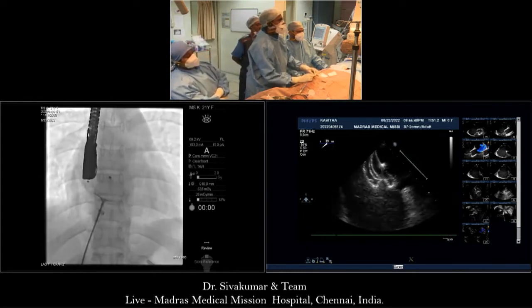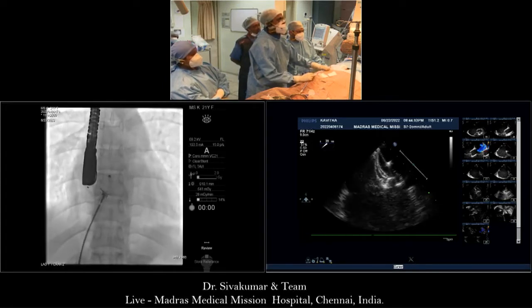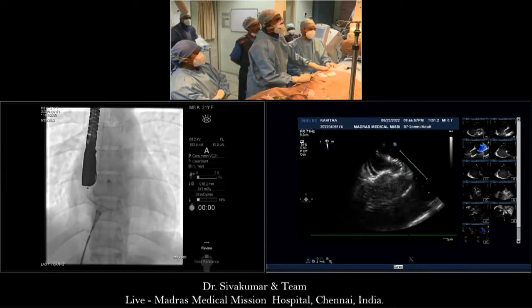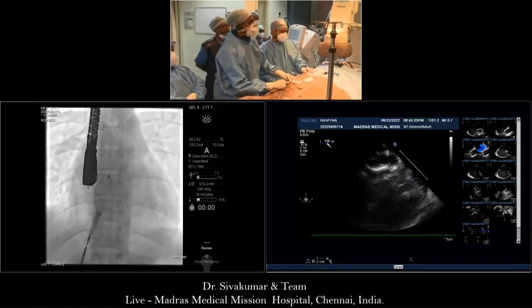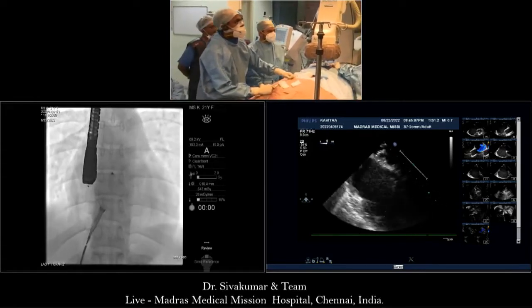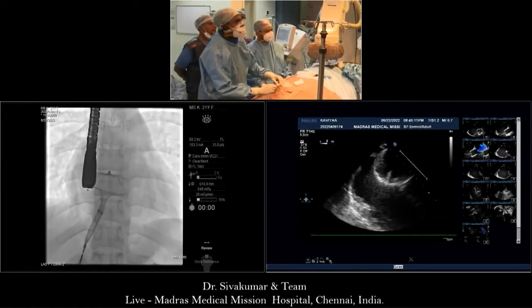It's the same position or slightly worse than the previous one. Is it definitely across the septum, though? That's the question. I'm not sure it fell in the same beautiful way the other one did. How much pull does he have? 0 degree. Just be there.